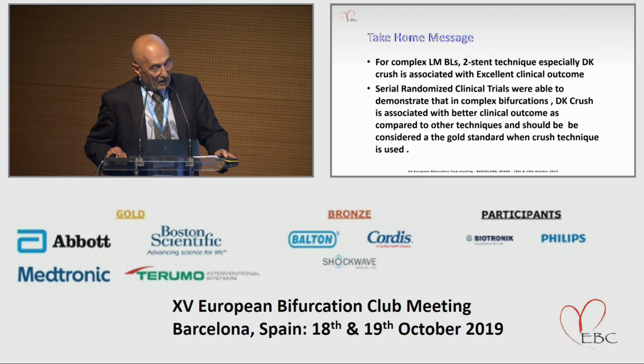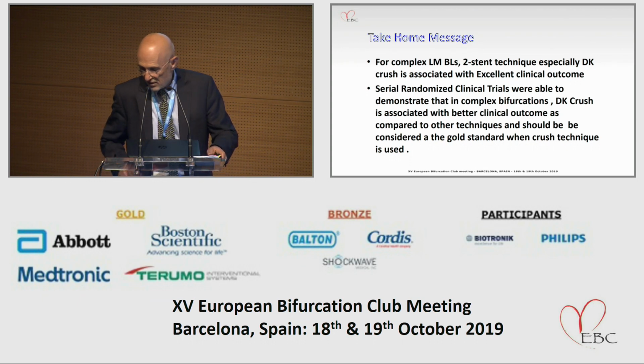So my final message is that for complex left main bifurcation lesions, the two-stent technique, especially DK crush, is associated with excellent clinical outcome. And serial randomized clinical trials were able to show and demonstrate that in complex bifurcation, DK crush is associated with better clinical outcome as compared to other techniques, and particularly with the classical crush, and should be considered as the gold standard when crush technique is used. Thank you very much for your attention.